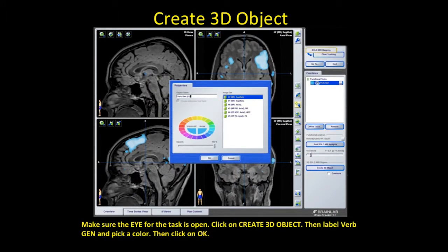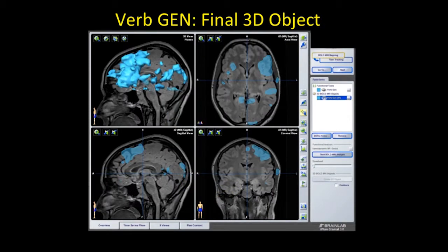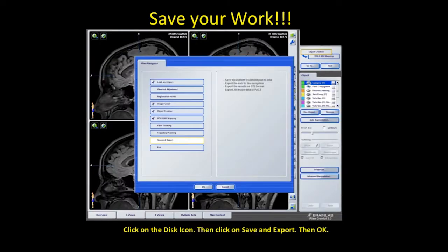In Brain Lab, you want to create 3D objects so you can manipulate the data and make plans for your neurosurgeon colleagues. Make sure the eye icon for the task you want — verb generation in this instance — is open. Create 3D objects, label it verb gen, and pick a color; in this case blue. Hit OK. This is your final 3D object. Click on the disk icon to save and export the data to your neurosurgery navigation software, then hit OK.